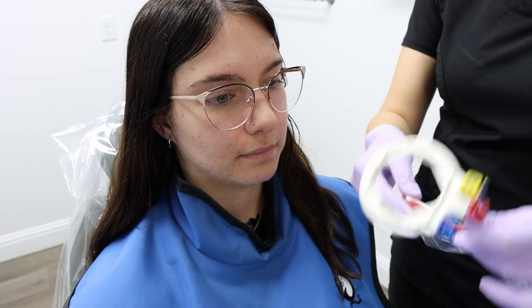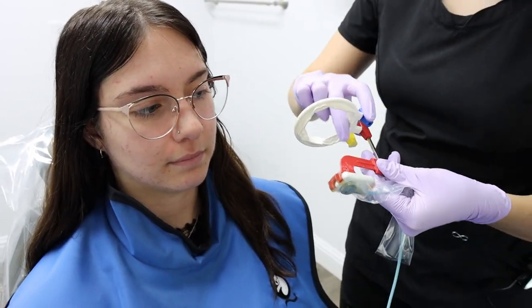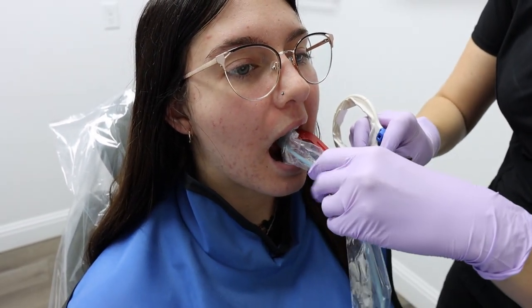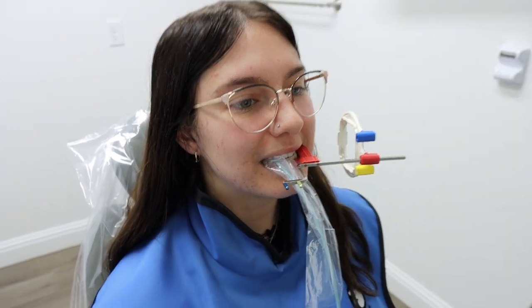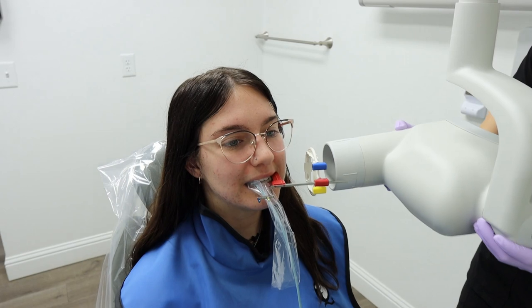Now we're moving over to the left side. For this you want to flip the sensor around, and we're going to start with the pre-molars. Again, you're going to angle the back of the sensor toward the anterior teeth and have them bite. You'll line up the x-ray head with the ring.